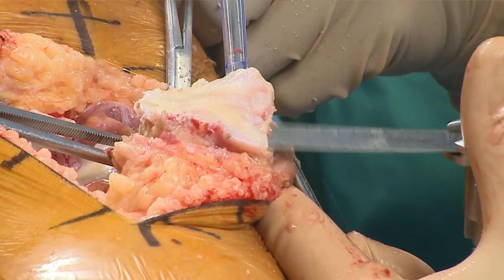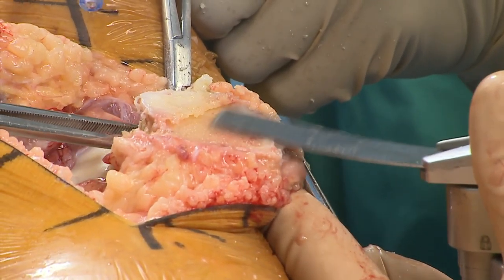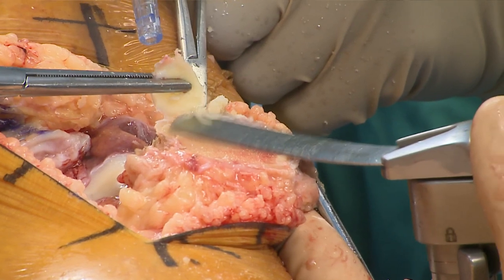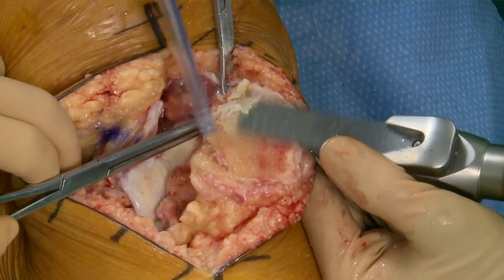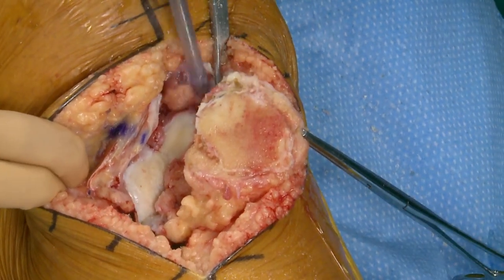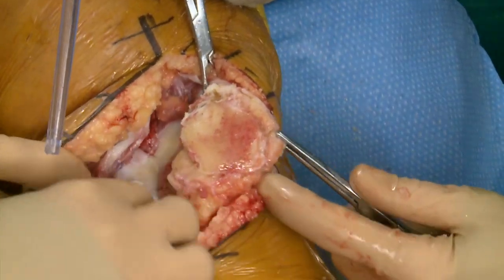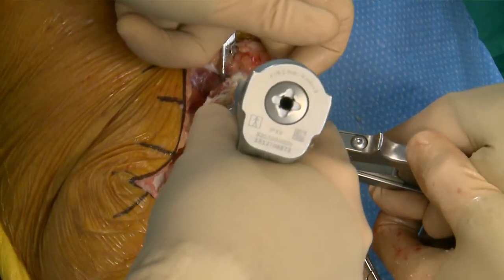My indications for not resurfacing the patella are now down to about five percent — usually in a young patient with really no arthritis, and most implant designs now are extremely patella-friendly. I haven't left a bunch unresurfaced, but luckily I haven't had to resurface any of those either. If they end up in somebody else's clinic with anterior knee pain, that's where it's coming from. I do pretty much a hundred percent PS, so we're down to 15 millimeters — about nine off, which I like.